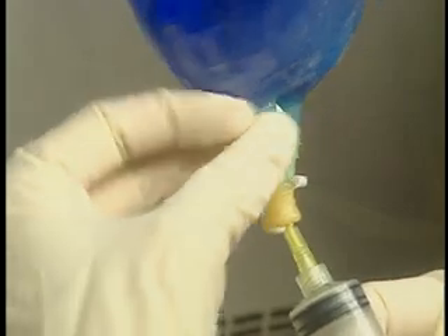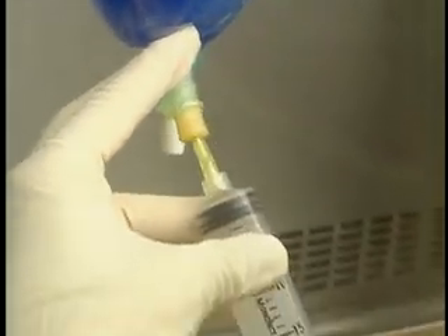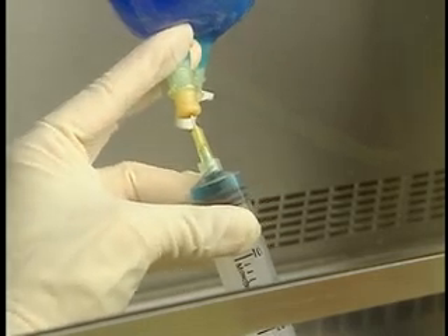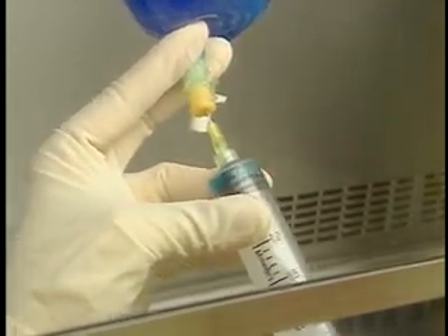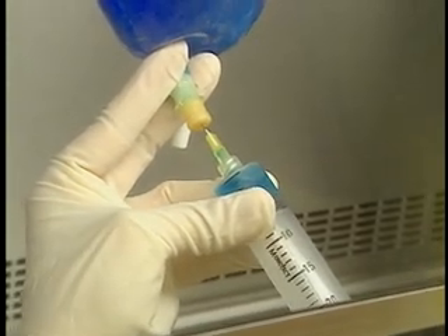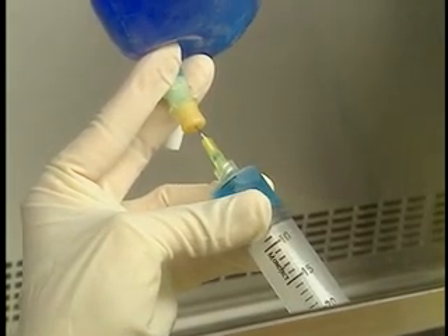Holding the barrel of the syringe from underneath, slowly insert the needle into the injection port at a 90 degree angle, making sure the needle does not pierce the sides. Pull back on the plunger end plate to draw in fluid until the desired volume is obtained. Work at a 70 degree angle throughout this operation.